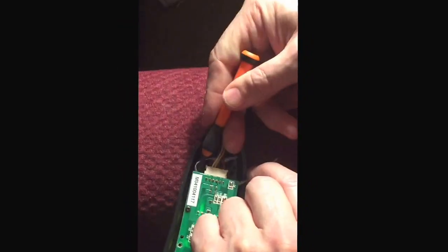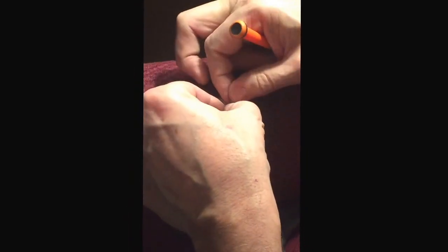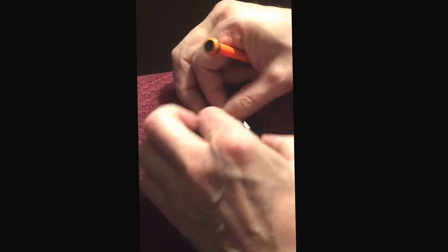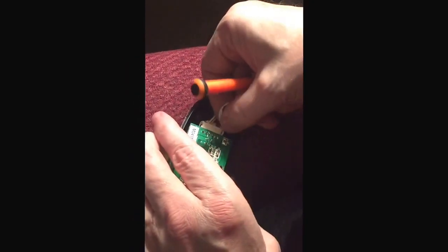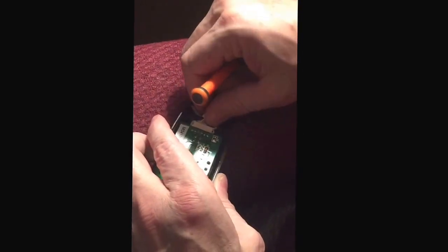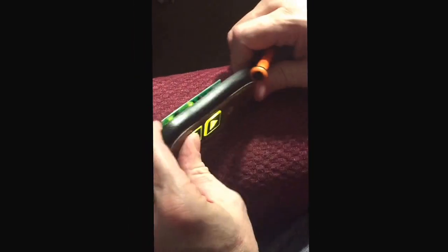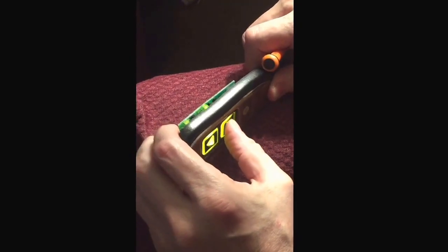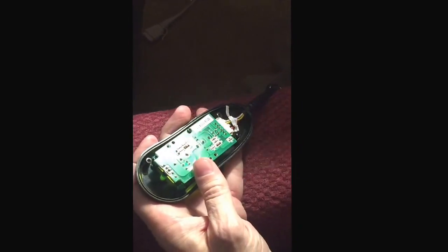Make sure it is grabbing. So there we go. So now I've got not just the little clip, but now I've got a mechanical wire that twists these together. Push that down like this. Okay, that piece goes in there like that. There we go. And we put it back together.